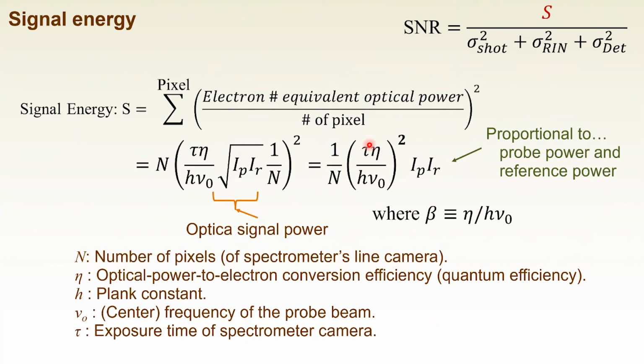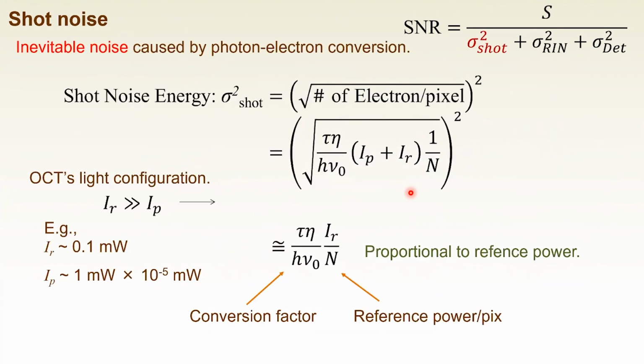But anyway, this signal energy, this sole signal energy, is not important. We need to always think about the ratio with the noise. But anyway, it's a signal property, a signal energy property. And then let's go to the noise part one by one.